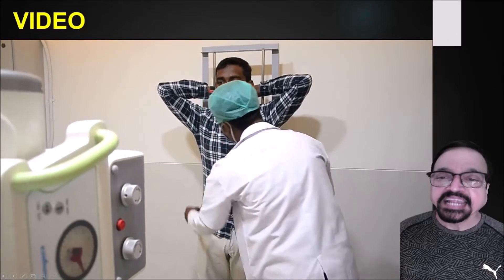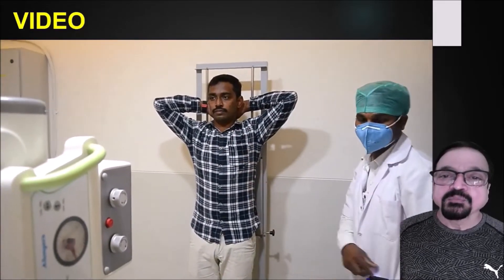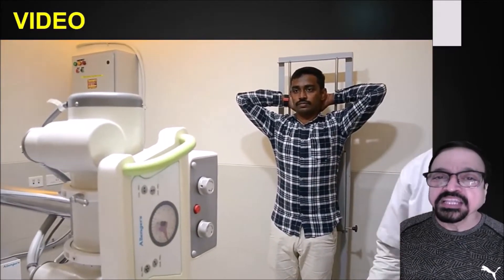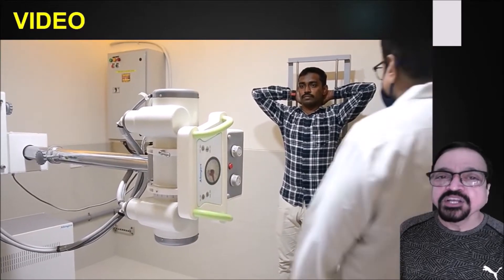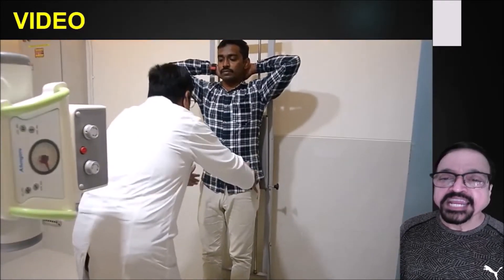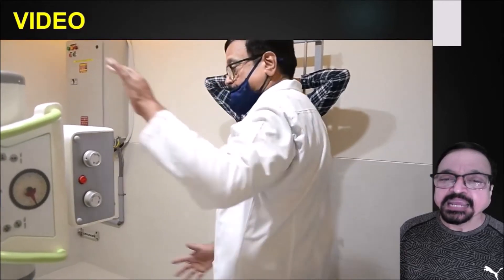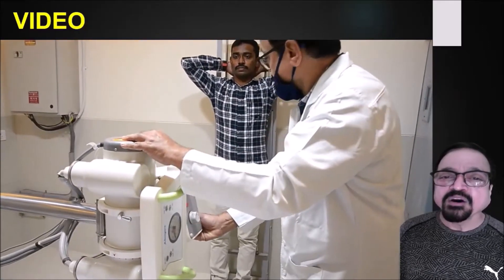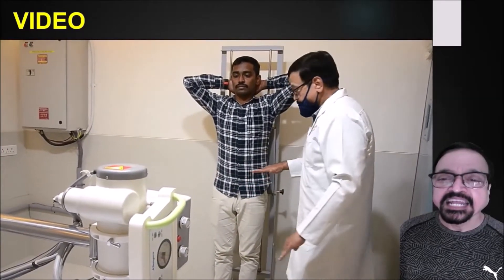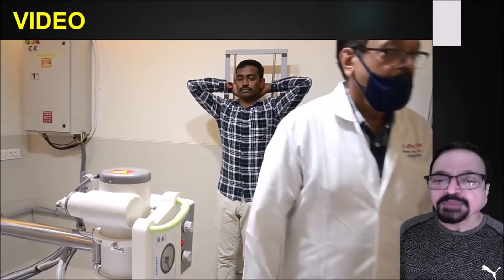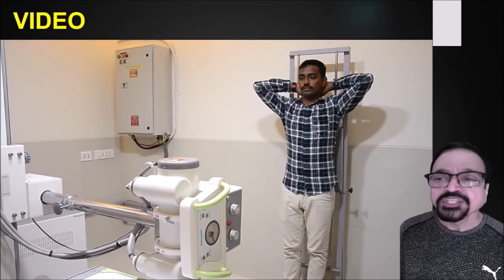Here we are seeing how a standing radiograph is done. Most lumbar patients will have nerve root compression, so it may or may not be possible for them to stand straight. However, there are certain clinical indications where a standing projection is required. This is for demo purposes, so the patient is standing well. What you must check is: first, that the patient is in correct AP position; second, the centering of the central ray, which can be from L1 to L5 or below depending on indication. For the lumbar spine, there is no angulation to the tube — it is straight.